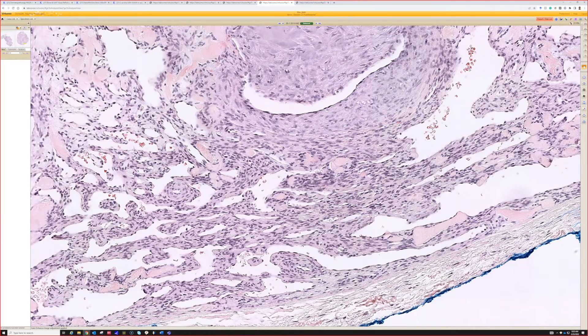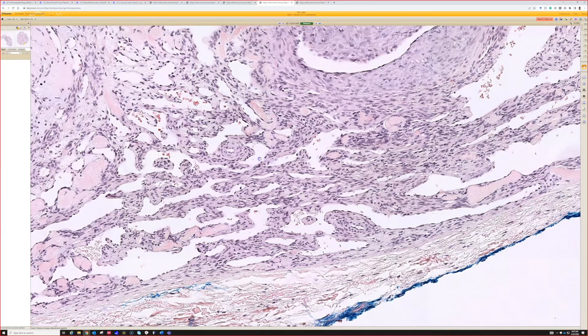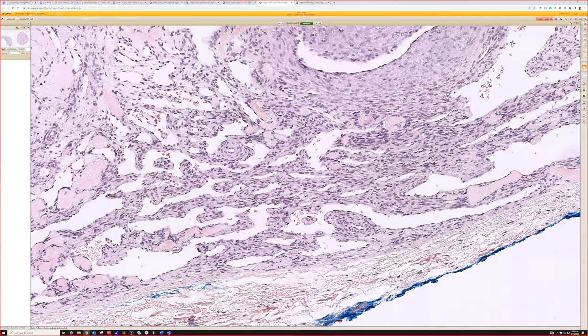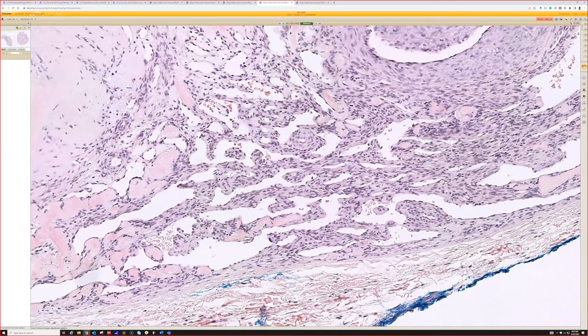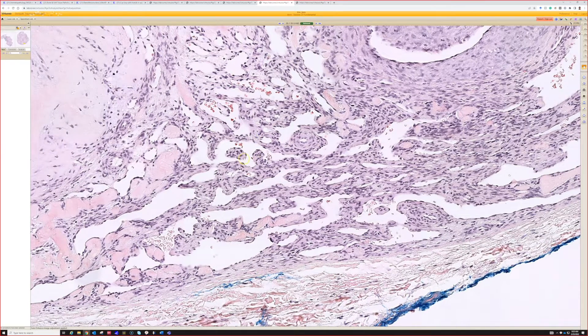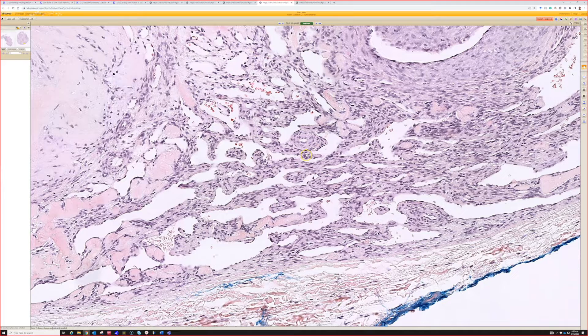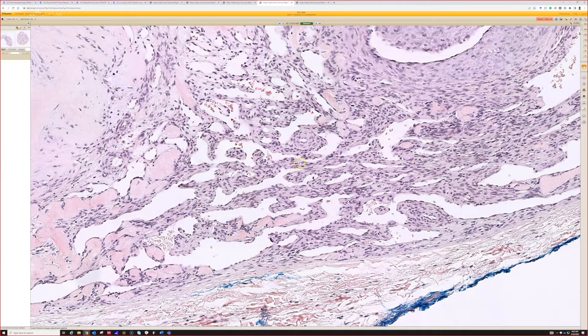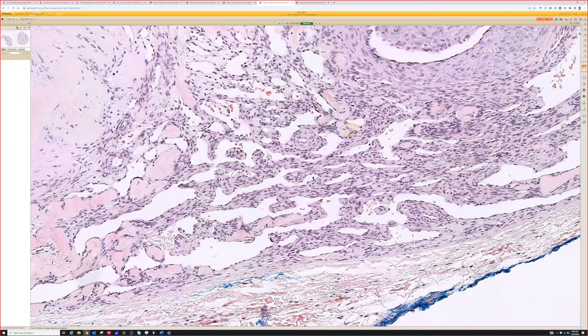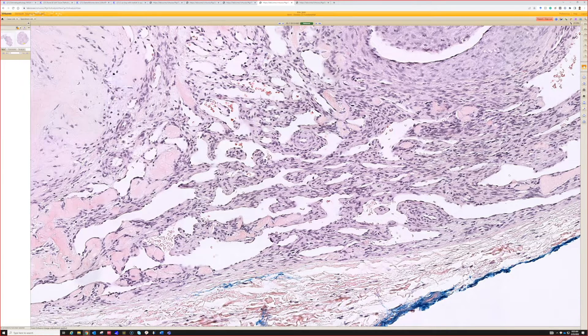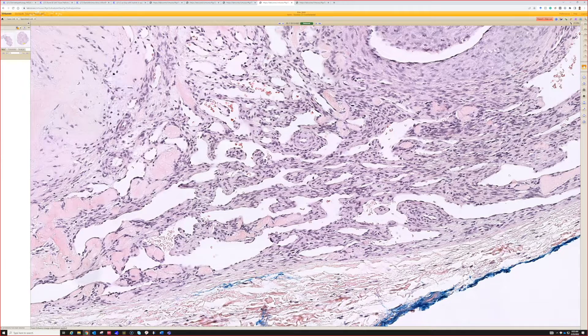They're kind of compressed between these very prominent dilated branching interconnected spaces. Some people would call these staghorn shaped vessels or hemangiopericytic vessels.